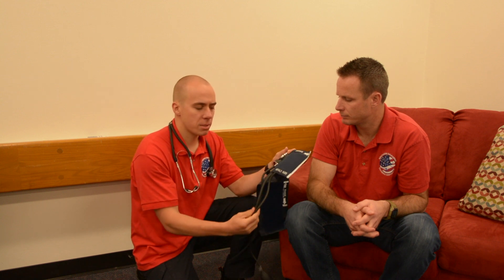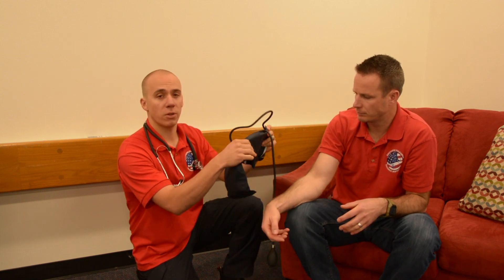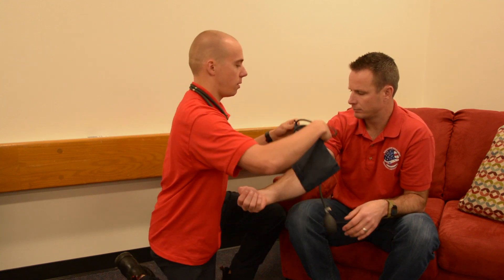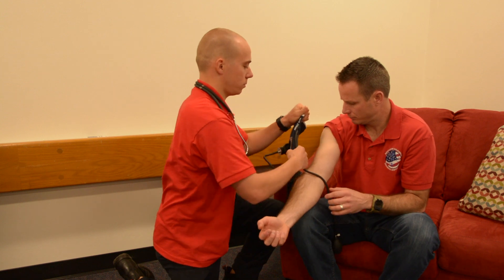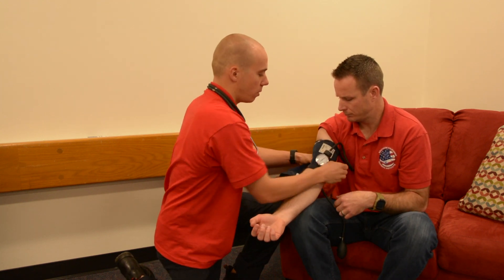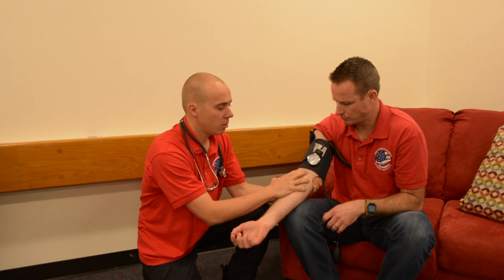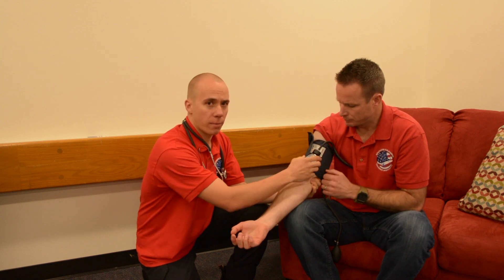When you're putting the blood pressure cuff on, sometimes the tubing gets in the way. A tip and trick is to flip the cuff backwards and then put it on their arm — that way the tubing is out of your way where your stethoscope needs to be, right here on the brachial.